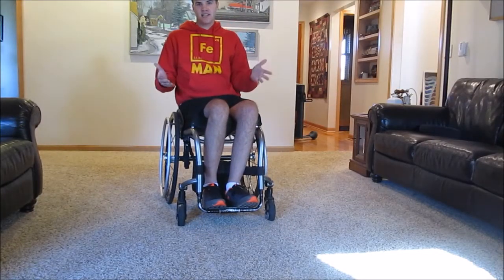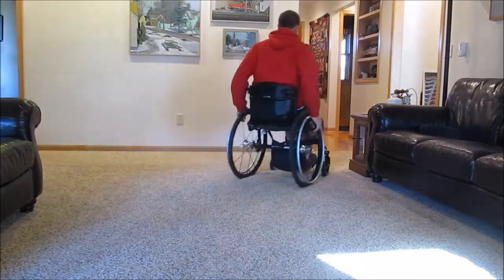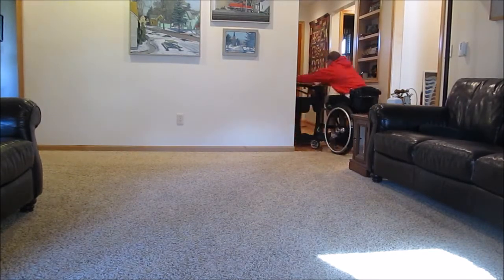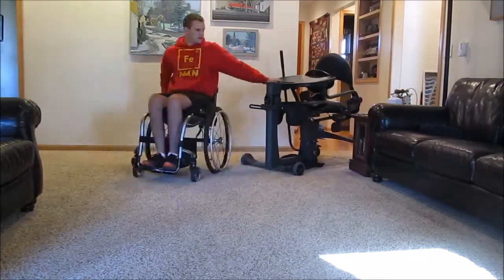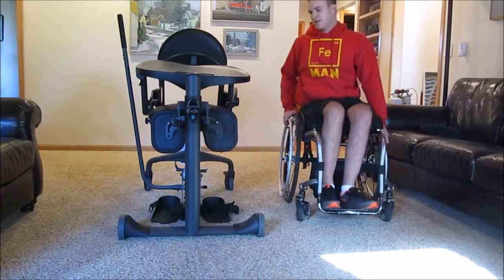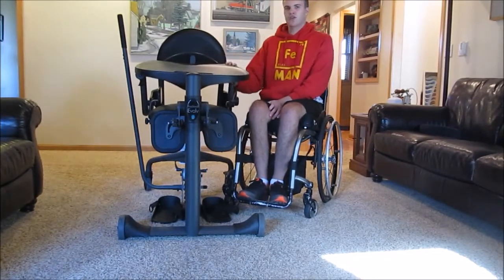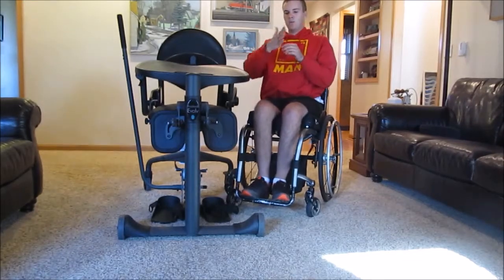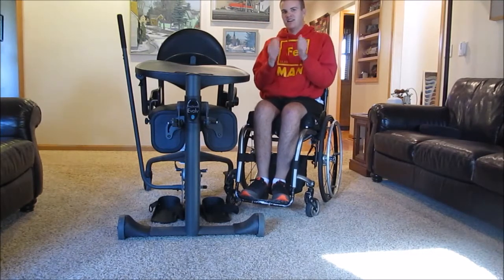Sometimes my stander isn't in the place that I want it to be, so I have to move it — I'm just going to grab it and bring it into the living room. That's a pretty good spot because I have enough room to park my chair next to it, lift it up, and transfer on in. Before I get in, I actually wear these leg braces that help with the arches of my feet, so I'm going to put those on.